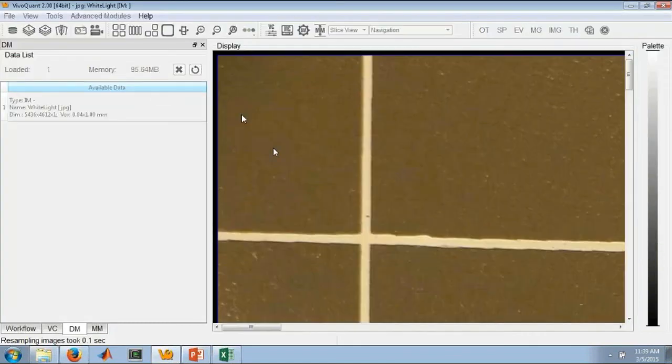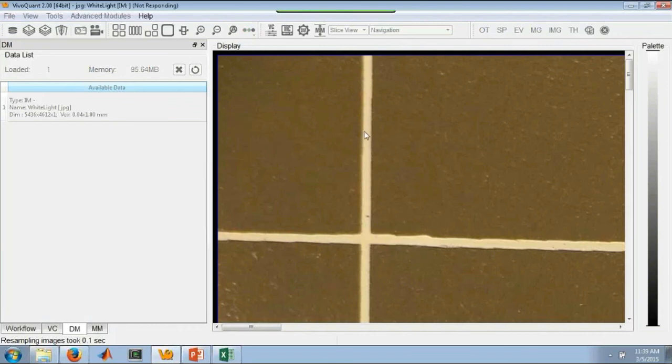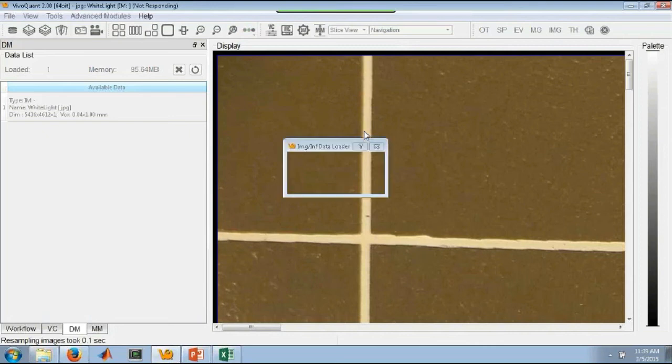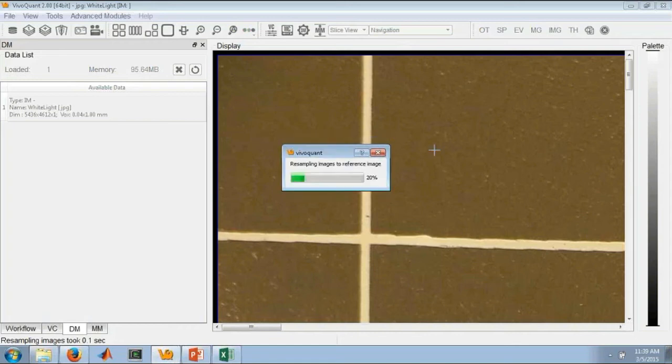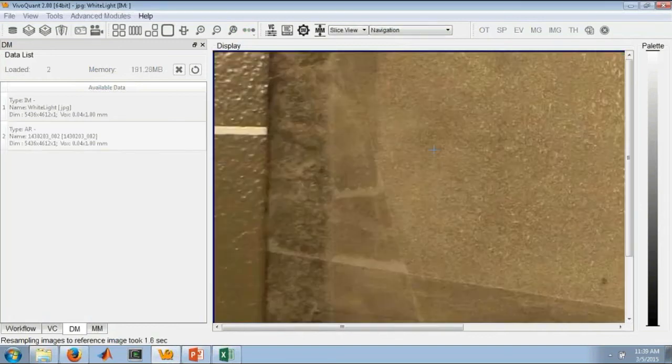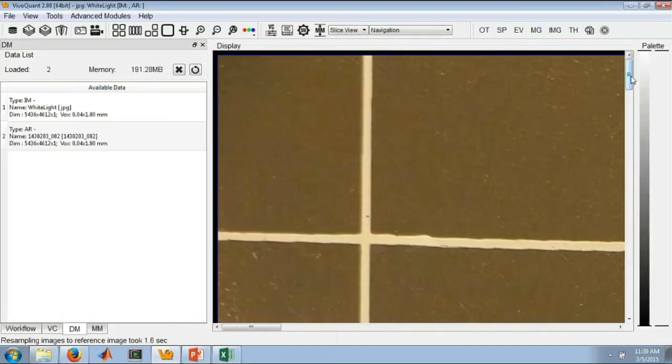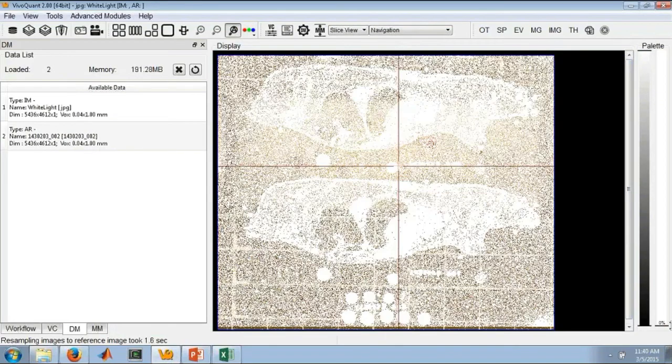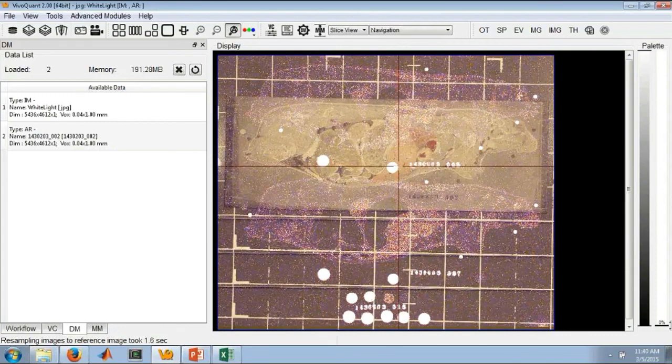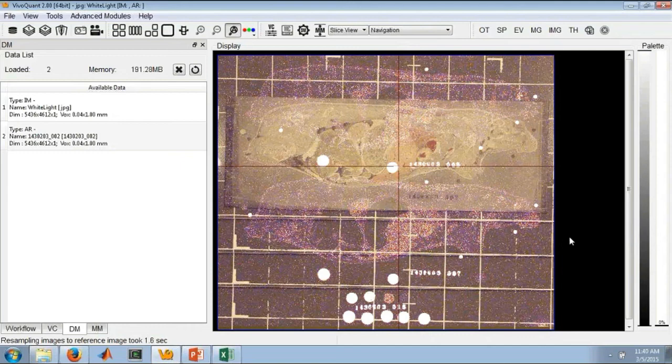It's going to ask for slice thickness. As I am only loading a single slice, this isn't of great interest to me right now. So now I have my data loaded, and if I pull down the color palette, you'll see there's some autorad data overlaid on the white light. It's not registered. I'll go through that in a minute. But the first thing that we'll want to do is perform some sort of calibration for this autorad image.